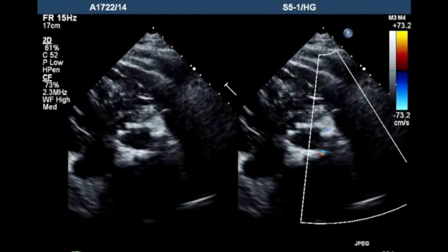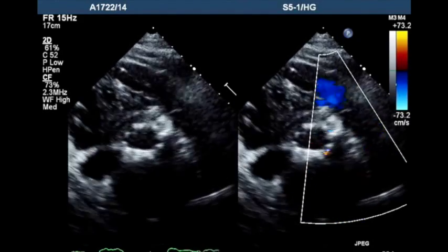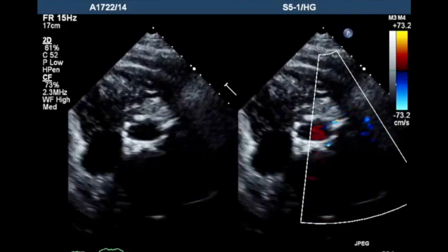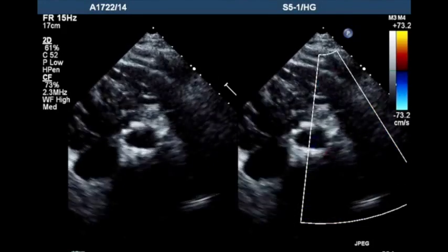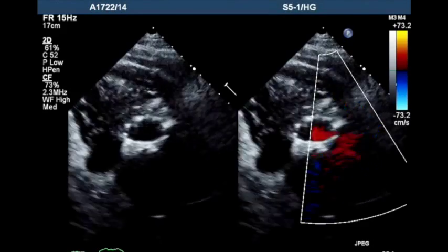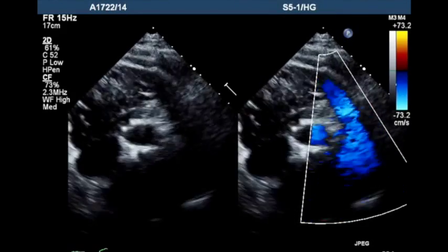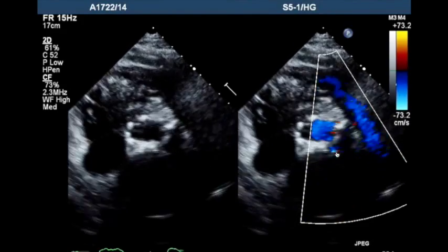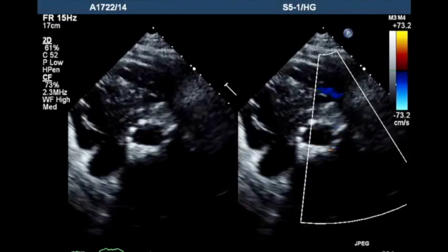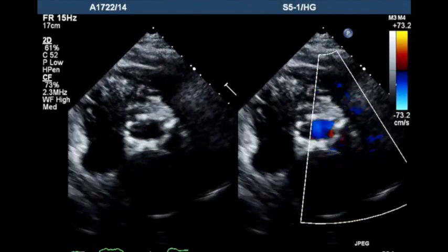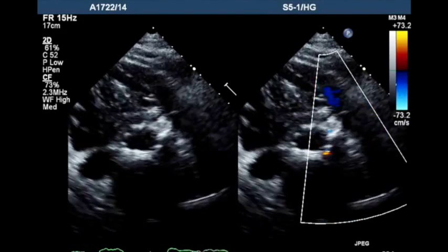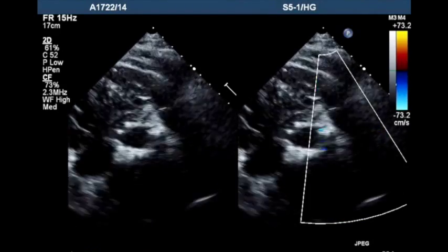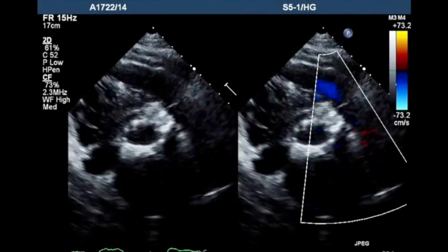This is a parasternal transthoracic view of this particular valve. You can see two small jets: one at 2 o'clock and one at 5 o'clock. Even adding those two jets together, they make up a very small proportion of the total circumference — which is how you semi-quantitatively grade the severity of paravalvular aortic regurgitation with this particular prosthesis. This is trivial paravalvular aortic regurgitation.